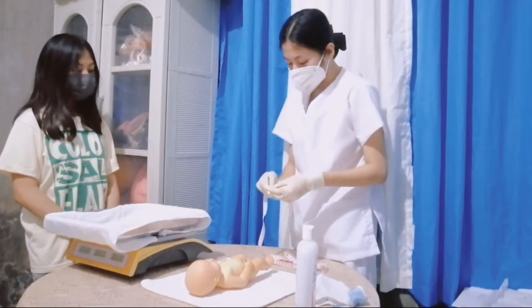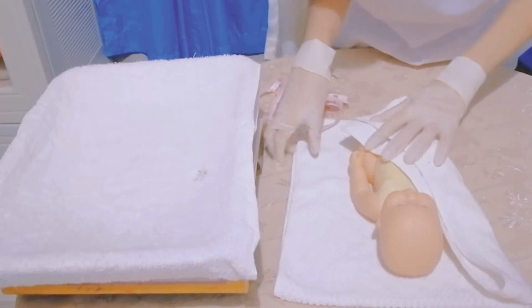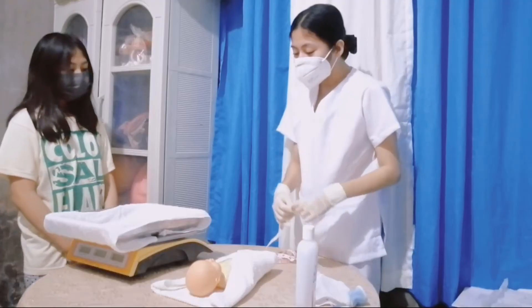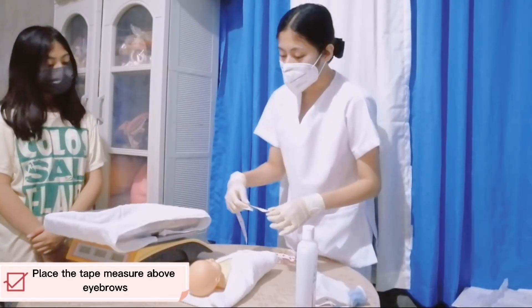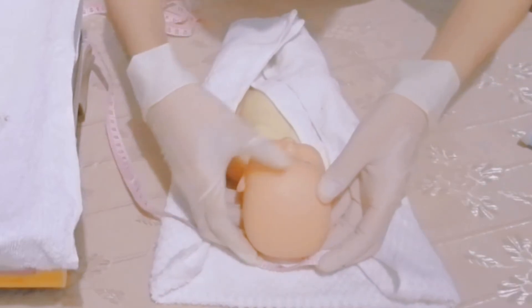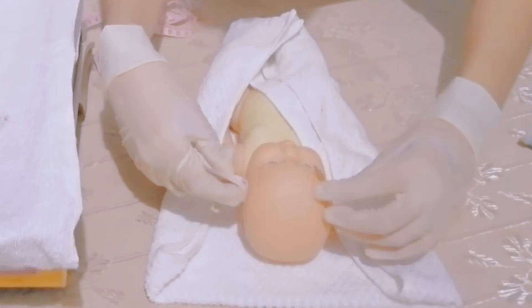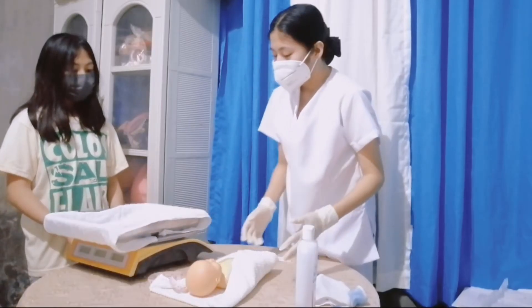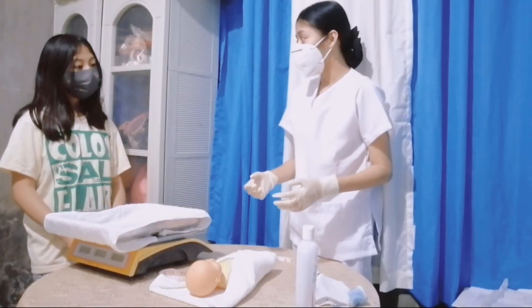Now we will proceed with measuring the head circumference. Since I will measure the head first, I will cover the rest of the body to prevent hypothermia. In measuring the head circumference, I will place a tape measure above the eyebrow of the baby — at least 2 cm above the eyebrow — around the most prominent area of the posterior head. The baby's head circumference is 33 cm. The normal value for a baby's head is within 33 cm to 35 cm. Therefore, your baby has a normal head circumference.